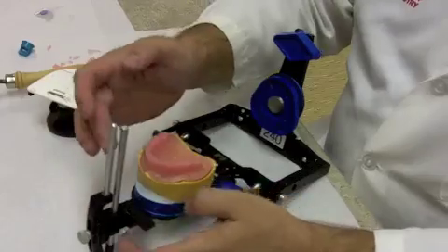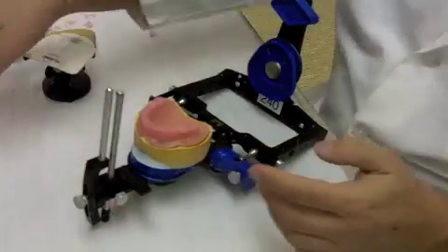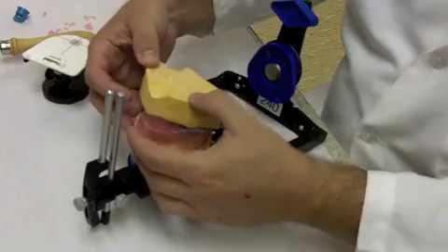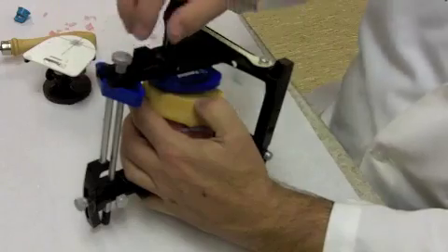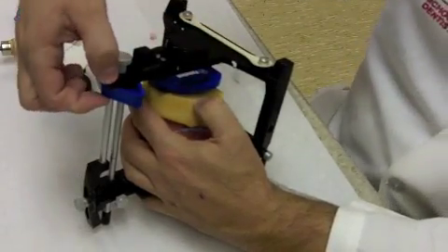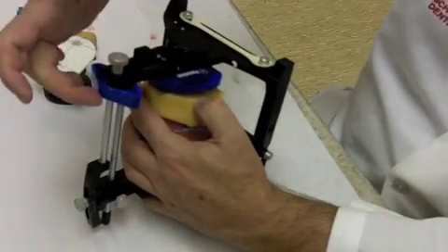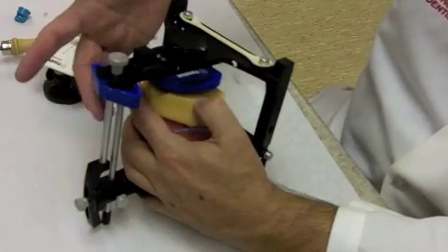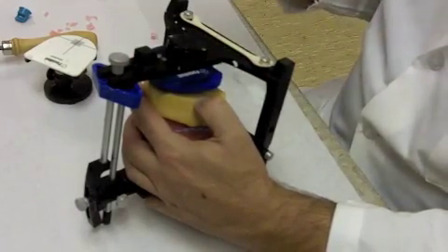This ensures that whenever I close this articulator, I'm not going to set the table down on that inner pin. It's going to touch the outer pin. And then with my registration material, with my mandibular cast, I'm going to close it, ensure that that table is contacting that outer pin that's set at 0. So we know everything's set at 0. This is what's going to maintain our vertical dimension of occlusion.